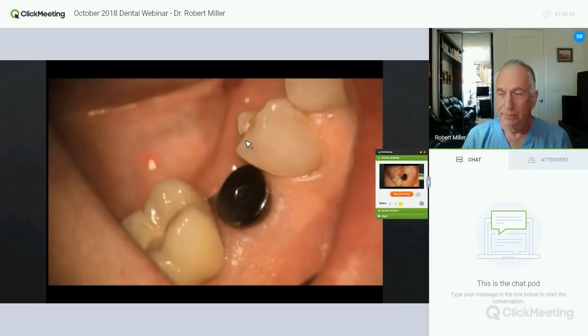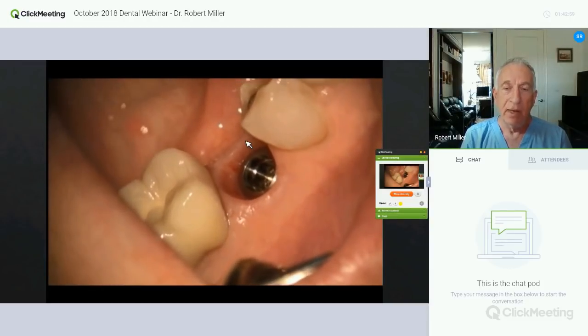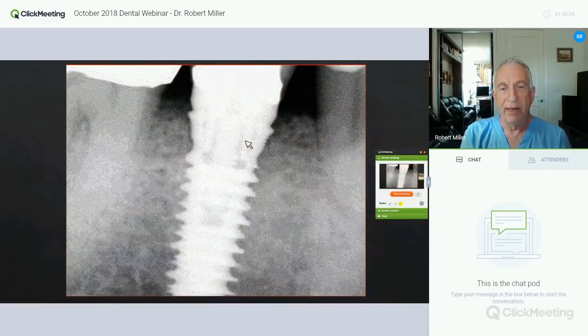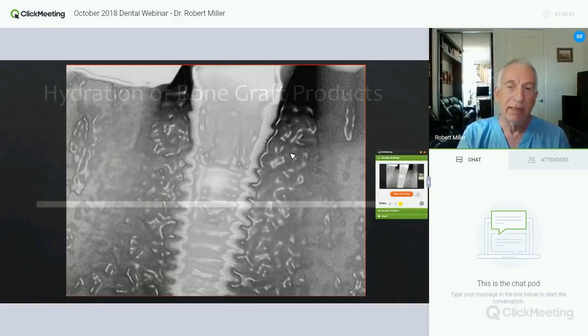This is what it looks like at 2 months. Go ahead and remove and look at the beautiful tissue complex around here. But as beautiful as that looks, when we start to look at the radiographs, here's the radiograph, and then here's a three-dimensional representation of that radiograph. Down at the bottom of the apical half, average bone to implant contact, but in the extraction site gap, look at the increased density of this bone that surrounds it. So this is a combination of a great surface of the implant plus Cerasorb M. So the free ionic calcium is contributing not just to early bone growth, but certainly to bone density. And that's extremely important to us in implant dentistry.